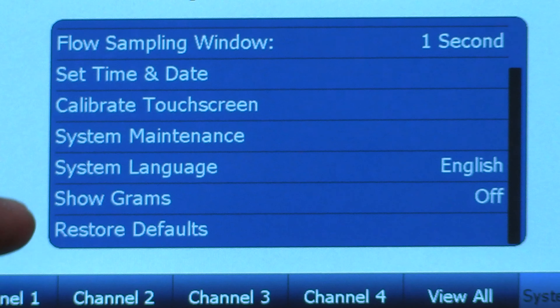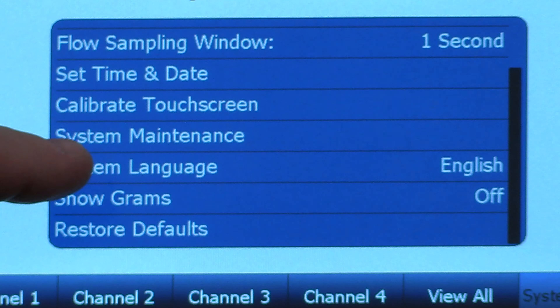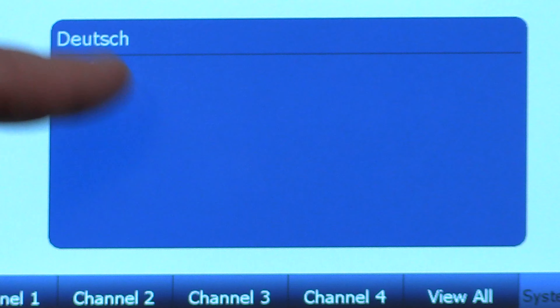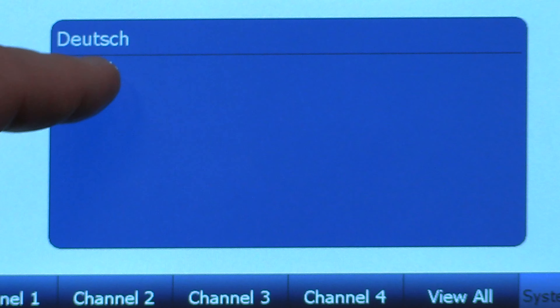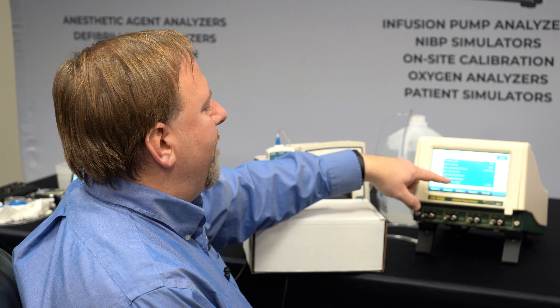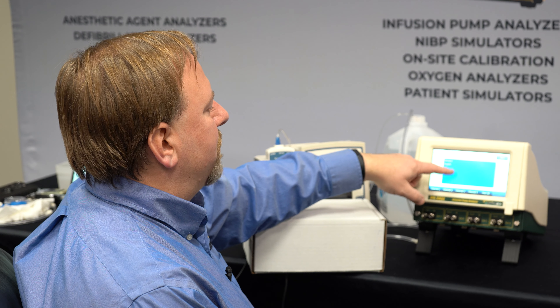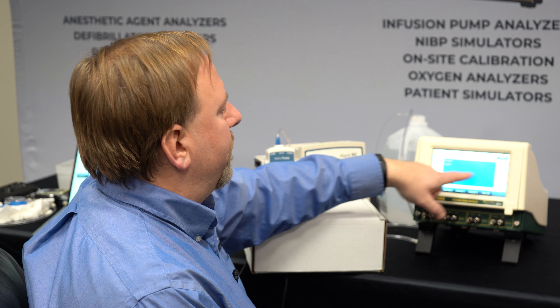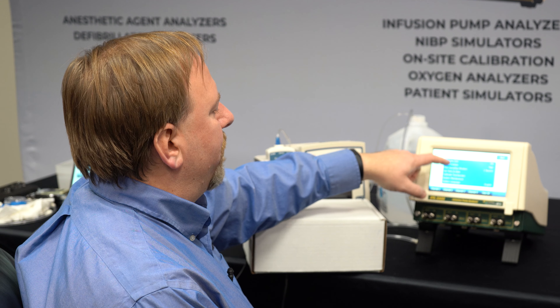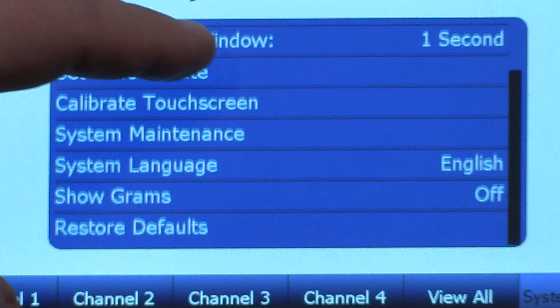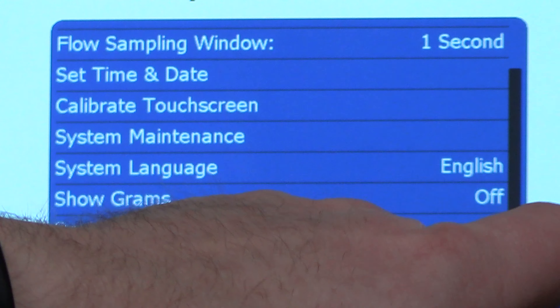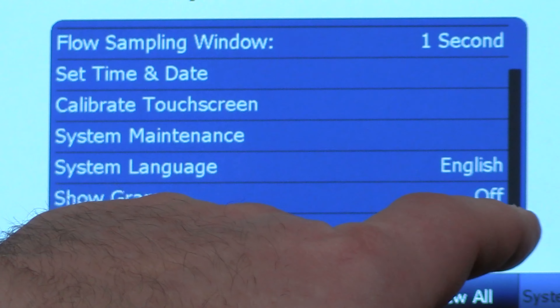The set time and date is there as well. It's also for calibrating the touch screen, and we can do system maintenance from this screen. We also have options for what language we want to use. We currently have English and German for the IPA 3400.